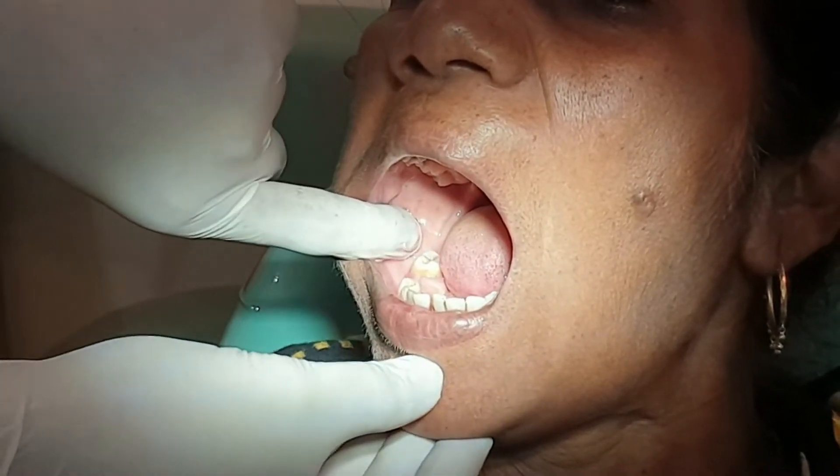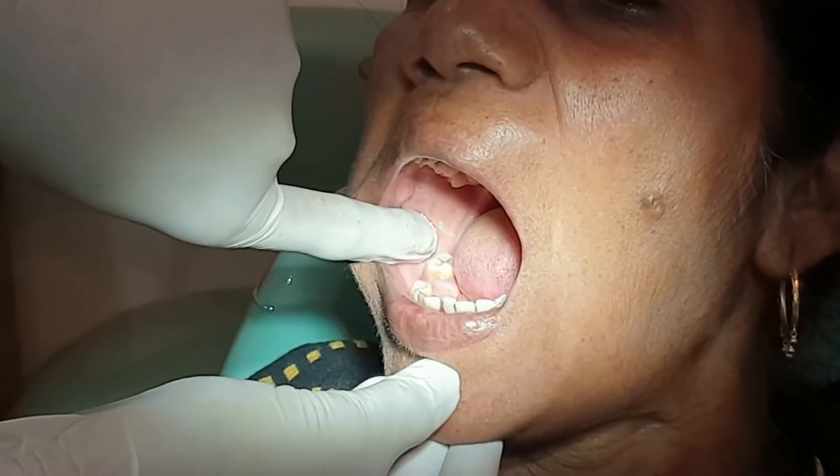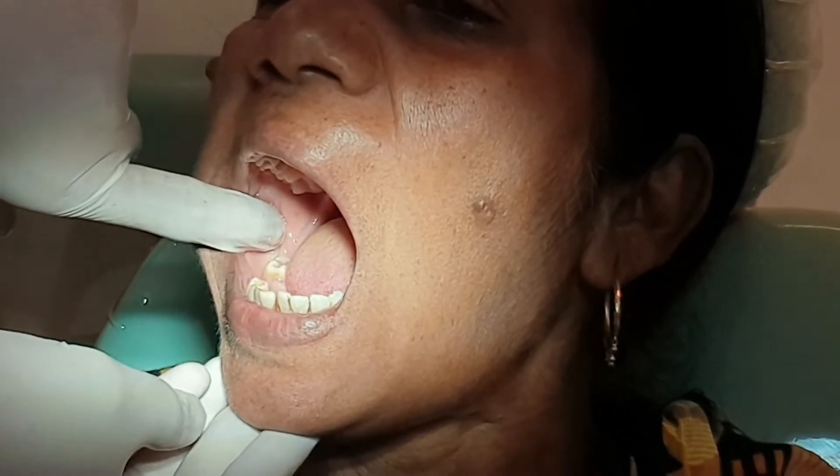The Coronoid Notch is a very important landmark in the Inferior Alveolar Nerve Block because it determines the height at which the injection has to be given — it is in line with the Mandibular Foramen. So we know that at the level of the Coronoid Notch, the Mandibular Foramen is present.